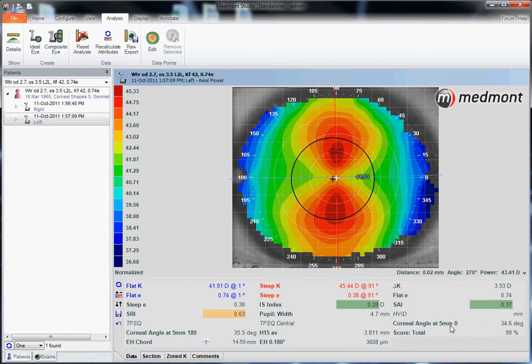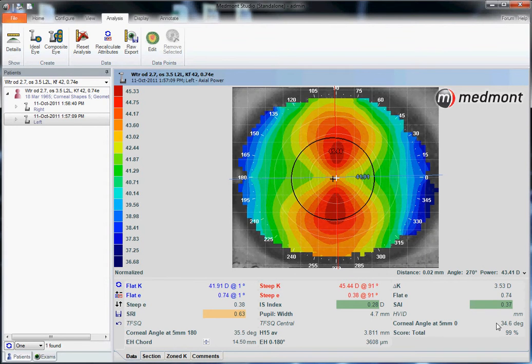The corneal angle at 5 millimeters out at 0 degrees, as well as the corneal angle at 5 millimeters out at 180 degrees. These angles are used to determine the anterior chamber depth for scleral lens fitting. The steeper the angle, the higher the anterior chamber depth; the flatter the angle, the lower the anterior chamber depth.